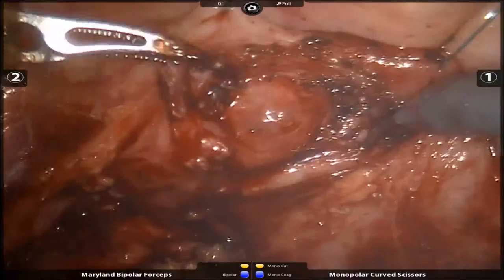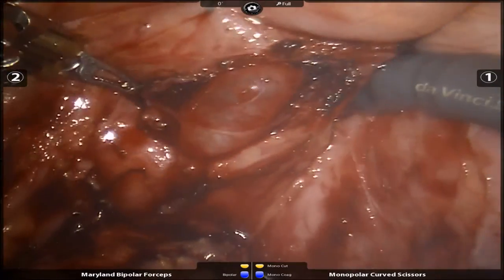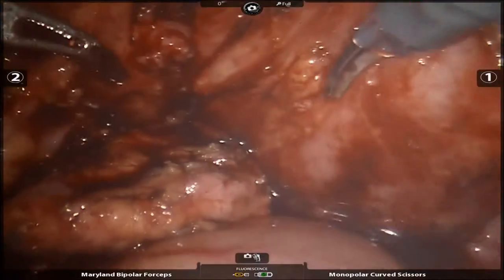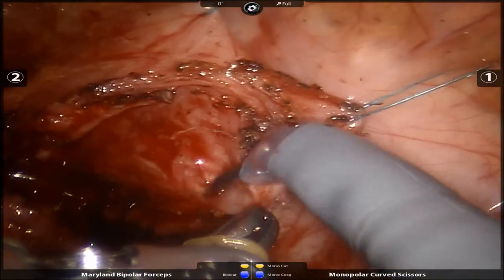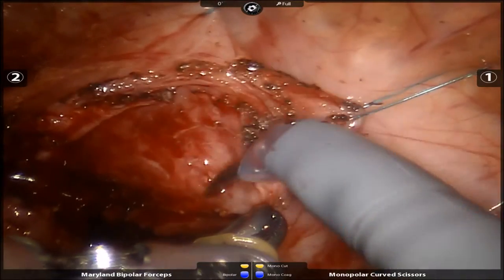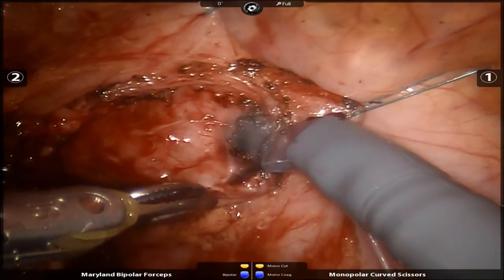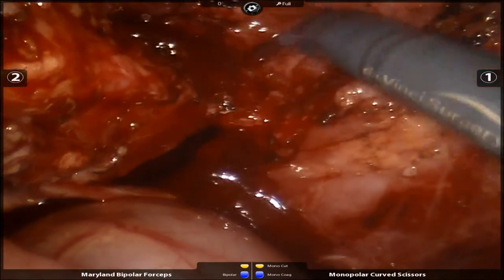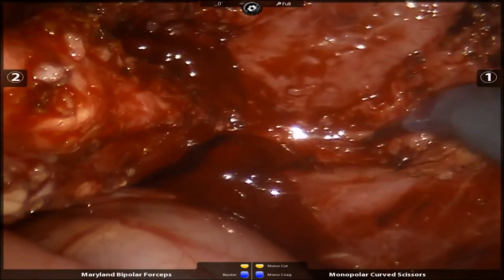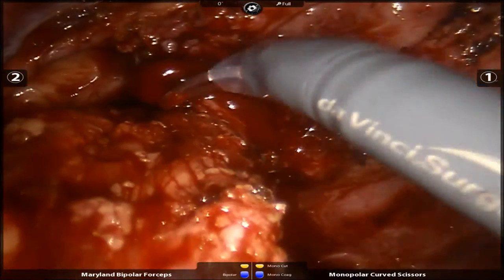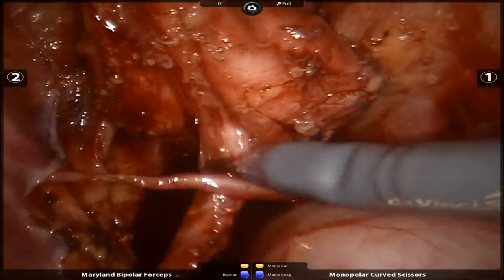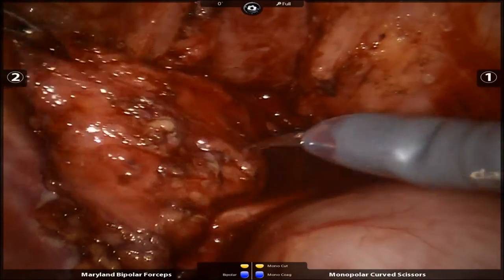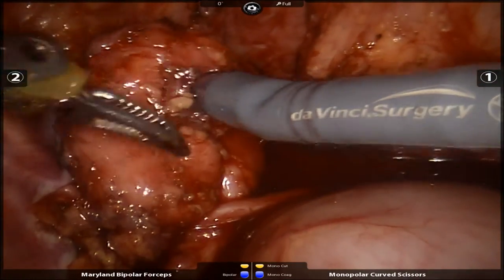To aid in visualization of the appropriate plane, the bladder is insufflated and pouchy mucosa can be seen. The remaining diverticulum is then dissected free from the UVJ very carefully. Note the close proximity of the left vas deferens.